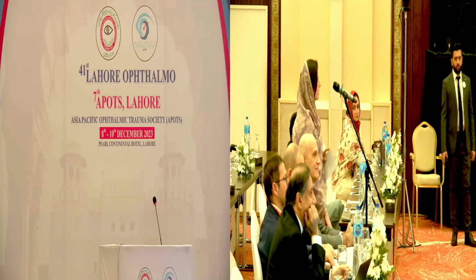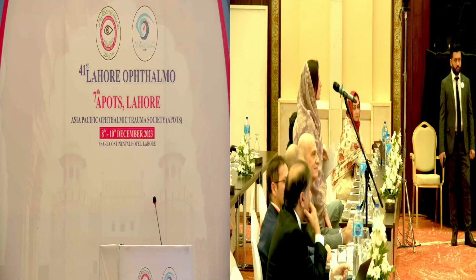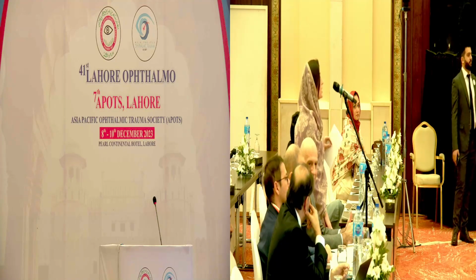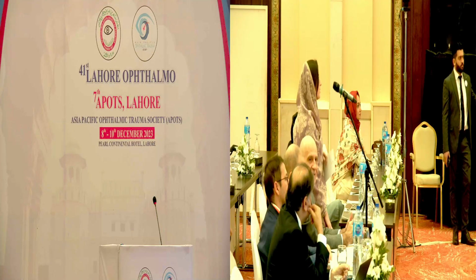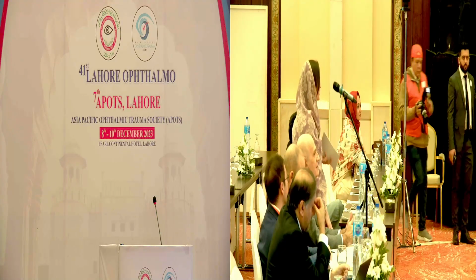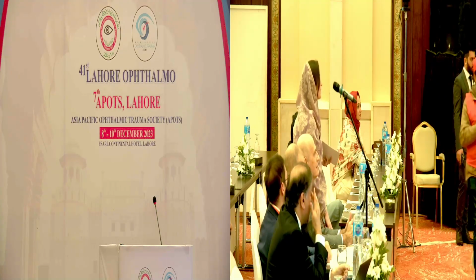Isn't that high, because it will produce traction on the vitreous base? I keep it at 100. While you are doing anterior vitrectomy, I personally keep it at 100, but I'm asking your suggestion. It should be low vacuum, definitely, 150 to not more than 200. Okay, I generally prefer 200. Yes, 200 is okay. Okay, thank you, sir.